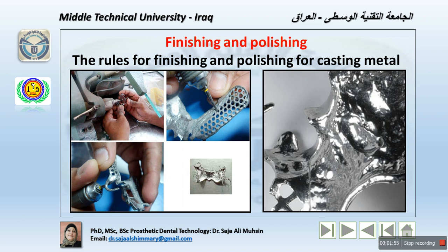Excessive pressure heats the work during the finishing of a metal framework. Any pressure exerted on the piece will produce high pressure with high heat. It crushes the abrasive particles, causes the wheel to clog and glaze, and slows the cutting. The most favorable way to cut, for example cutting the sprues as the first step, is using a cutting burr at low speed with gentle cutting. High speed will generate heat in the metal, regardless of whether you are holding it manually or using forceps.